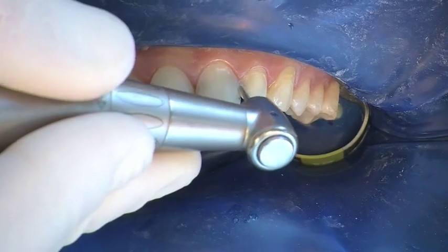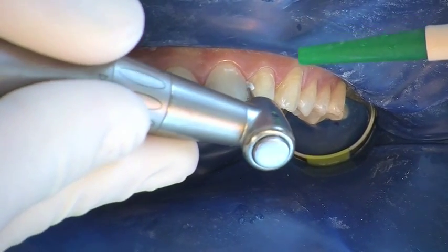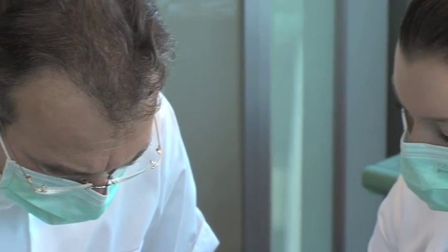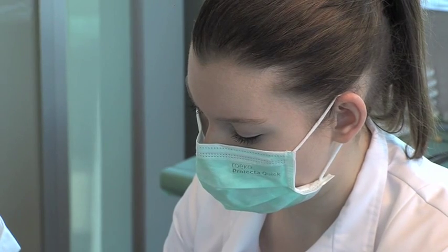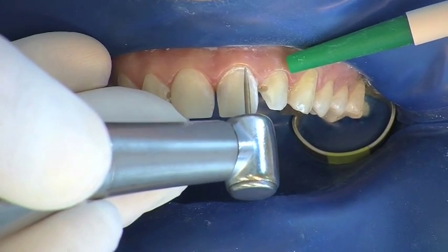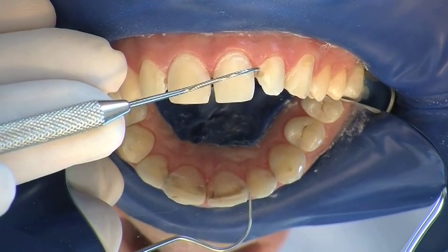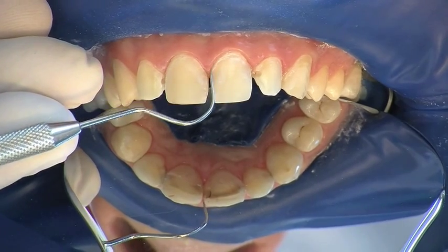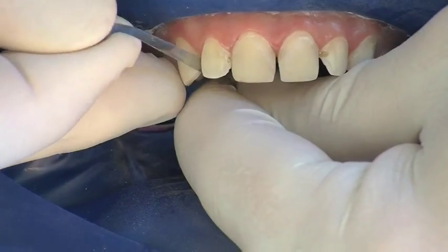Caries in the dentine is removed in the conventional way, as are demineralized and discolored parts of the enamel. Special attention should be given to cervical parts of the enamel. The caries has been removed and all facial parts of the enamel have been treated. The enamel is also treated interdentally to improve conditioning.